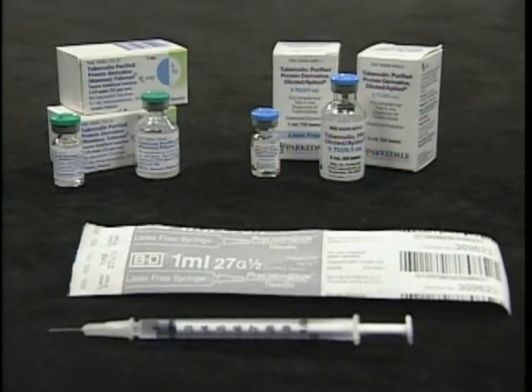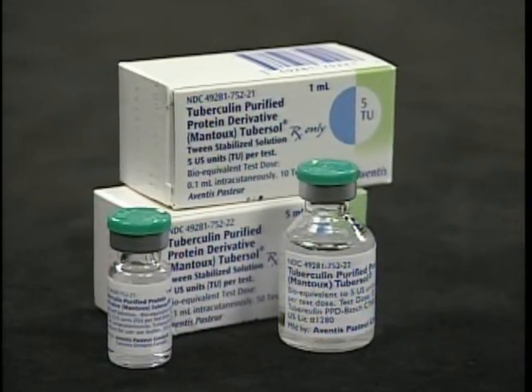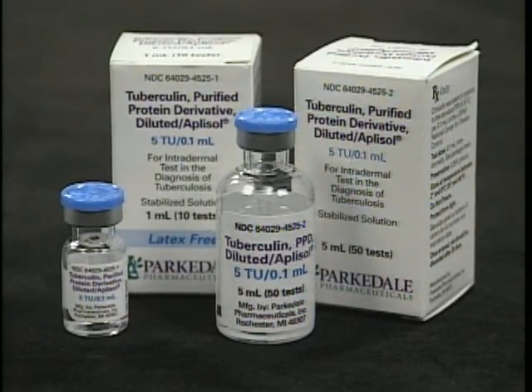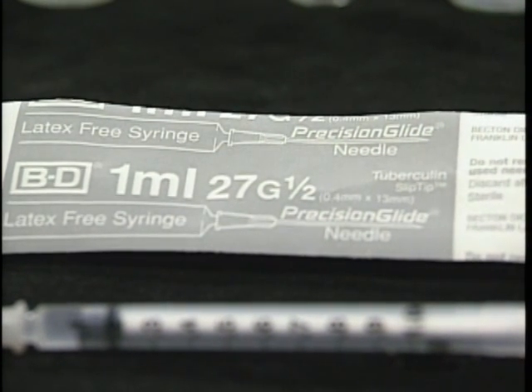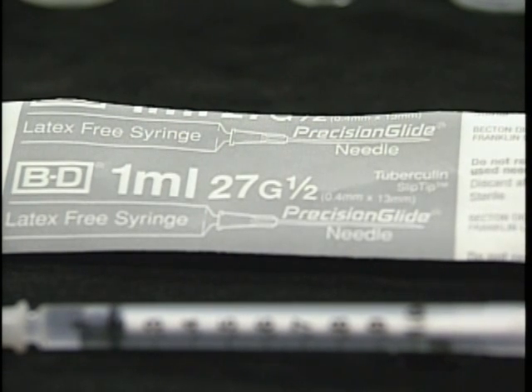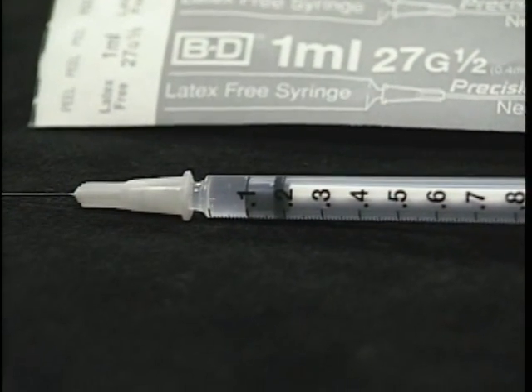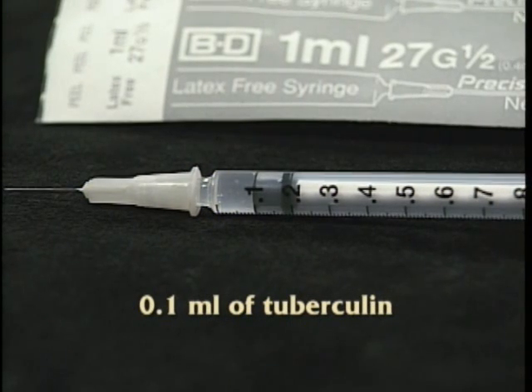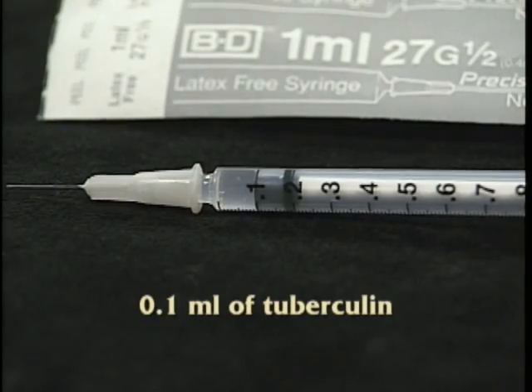Tubersol and Aplisol are the two commercially available tuberculin products. The multi-dose vials contain tuberculin for either 10 or 50 tests. The tuberculin is administered using a single-dose disposable tuberculin syringe that has a 1/4 to 1/2 inch 27-gauge needle with a short bevel. In the United States, the Mantoux tuberculin skin test consists of an intradermal injection of exactly 1/10 of a milliliter, which contains 5 tuberculin units.